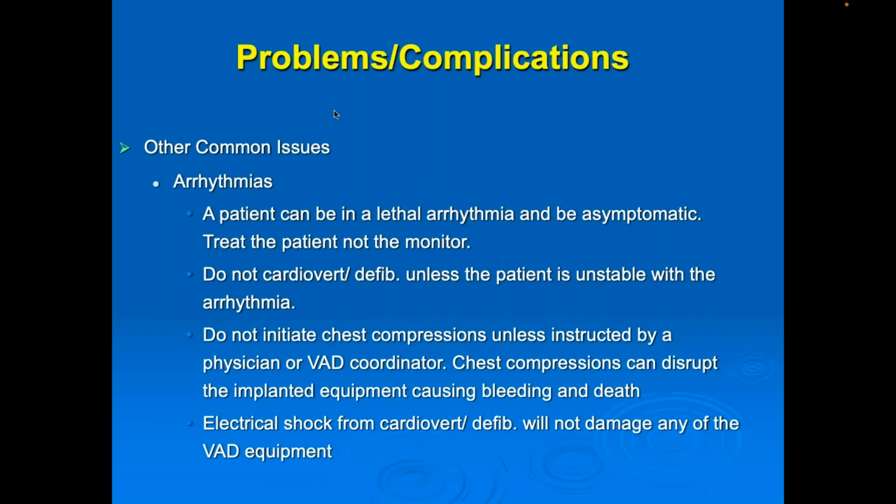A patient can be in a lethal arrhythmia and be asymptomatic. Treat the patient, not the monitor. Do not cardiovert or defib unless the patient is unstable with an arrhythmia. Do not initiate chest compressions unless instructed by a physician or a VAD coordinator. Chest compressions can disrupt the implanted equipment, causing bleeding and death. Electrical shock and cardioversion or defibrillation will not damage any of the VAD equipment.